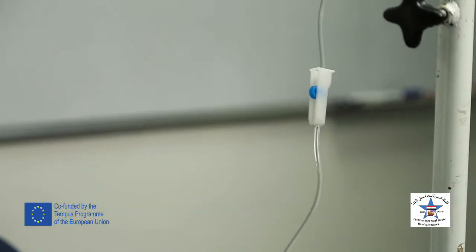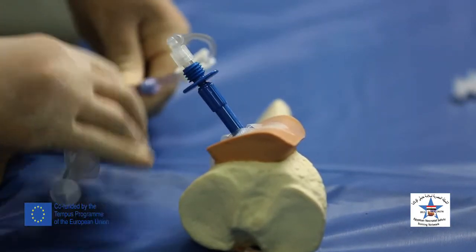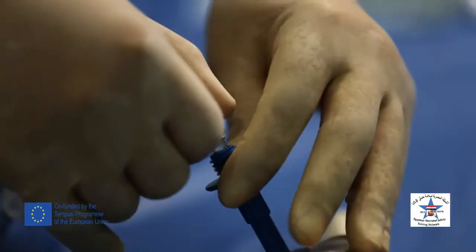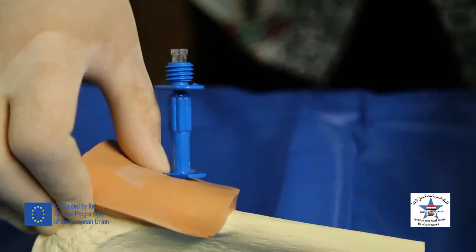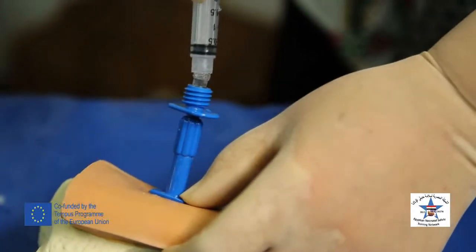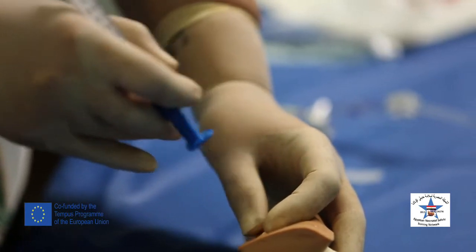To remove the intraosseous cannula, we stop the IV fluids, disconnect the tubing, remove the adhesive tape, connect a syringe to the cannula, and by rotating the cannula with the syringe, remove the cannula from the bone.